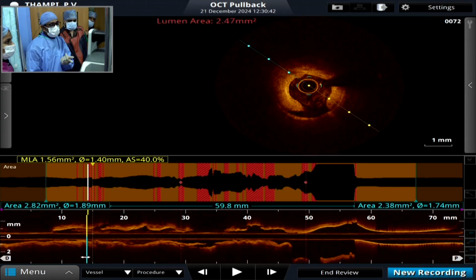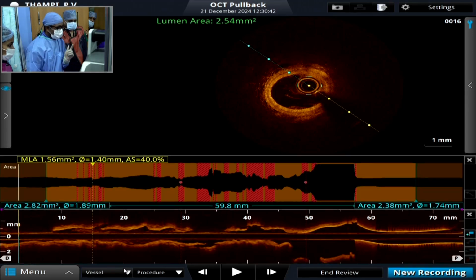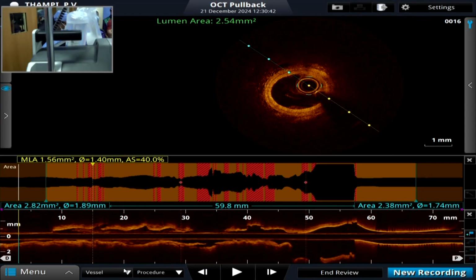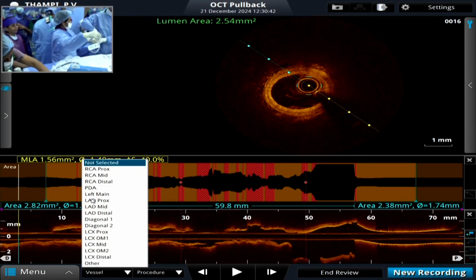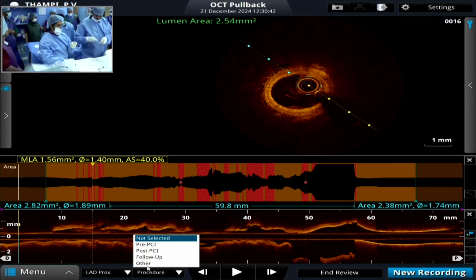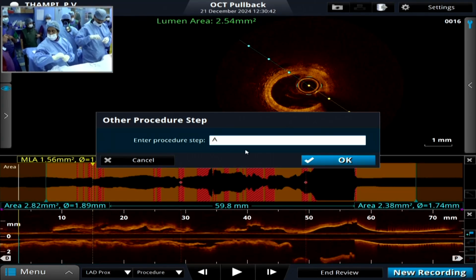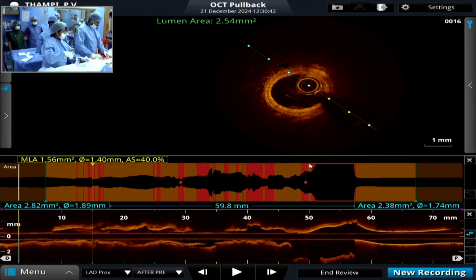It should go in 2.5 by 48. Then 2.75 and 3 mm NC balloons. Pardon me? 2.75. Distally, it's only 2.5, and proximally, it's coming to 3.2, 3.3. So proximal, we'll go with a 3 mm post dilatation, and in the distal half, 2.75 at low pressures.